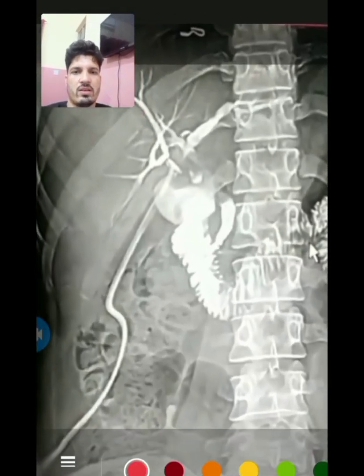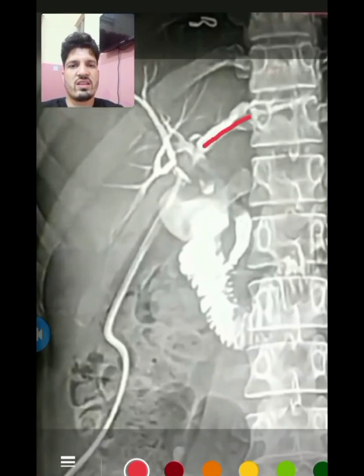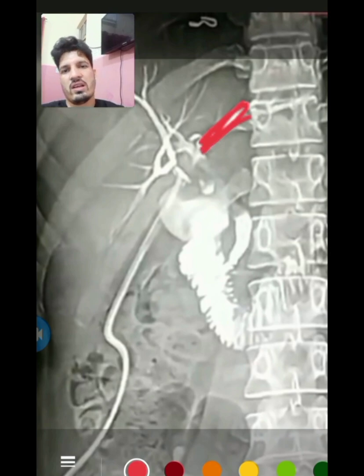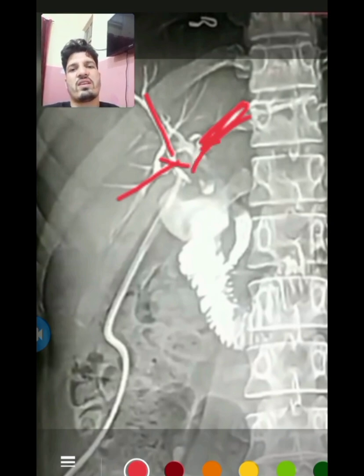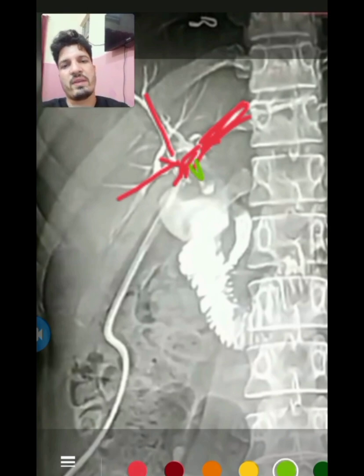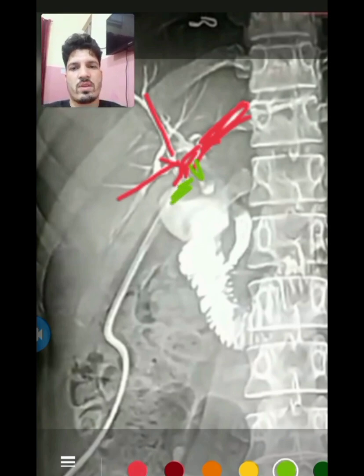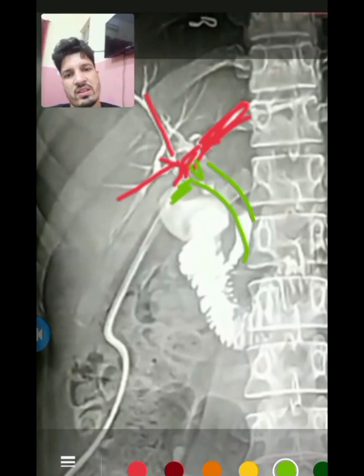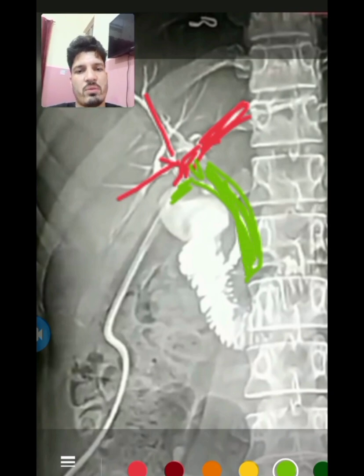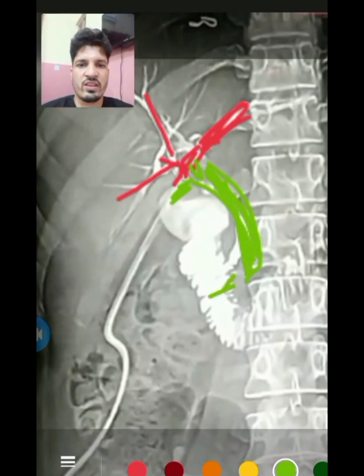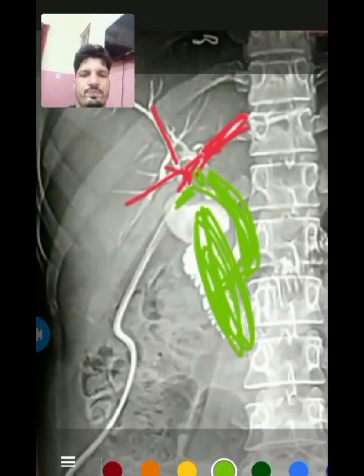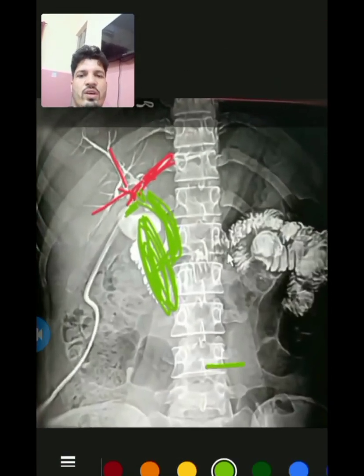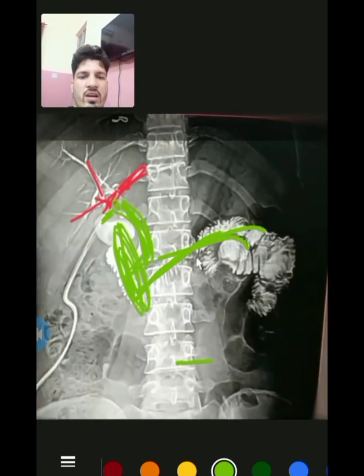This is the left hepatic duct, this is the right anterior and right posterior — they combine to form the right hepatic duct. The right hepatic duct and left hepatic duct combine to form the common hepatic duct, which then combines with the cystic duct to form the CBD — the common bile duct — which enters the duodenum at the second part at the ampulla of Vater. You can see contrast going into the duodenum and also into the jejunum.